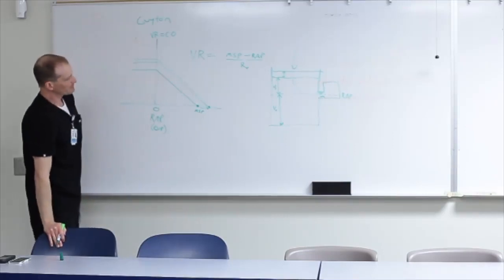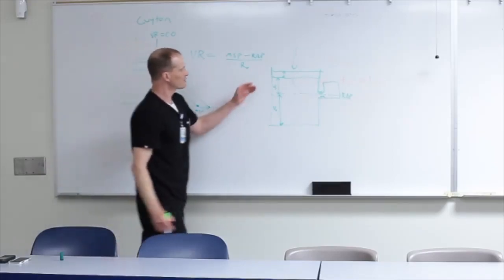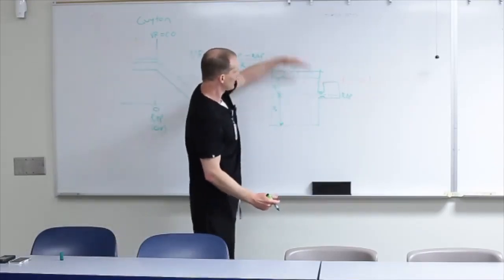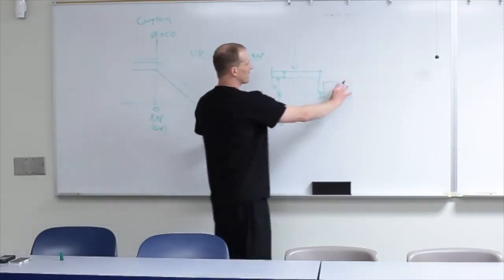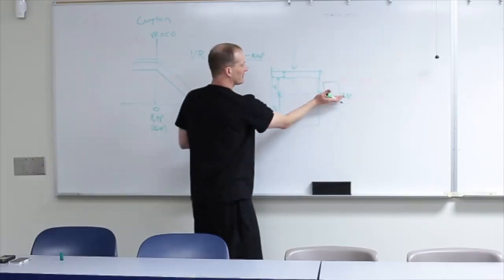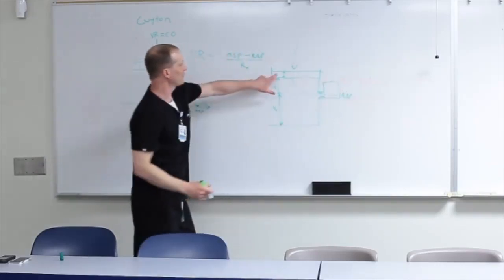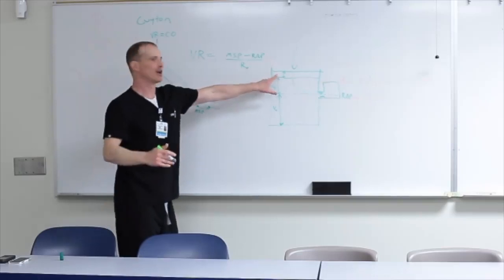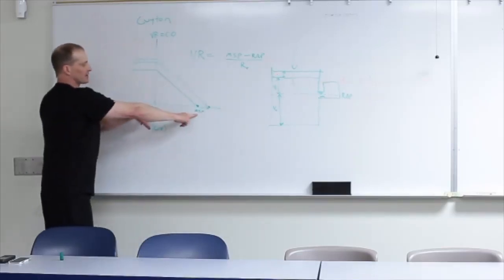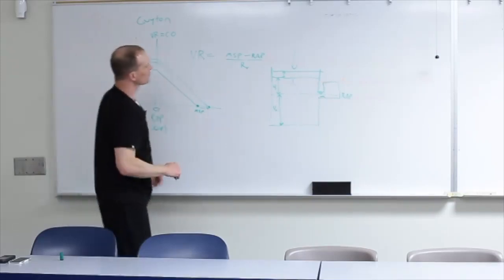All right, so the other thing we can do, and by the way, if you notice, because we just added fluids in, we're going to kind of bump up this pressure just a little bit too, right? So the IVC is going to come up a little, right? But hopefully we increase the mean systemic pressure more than we increase the right atrial pressure, okay?